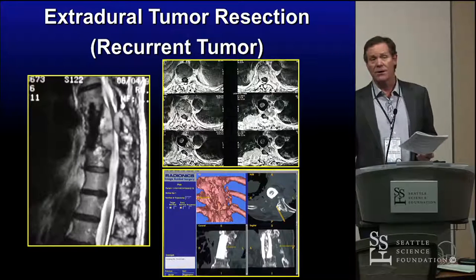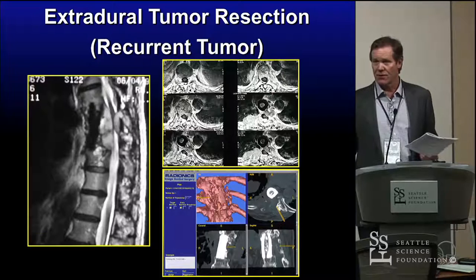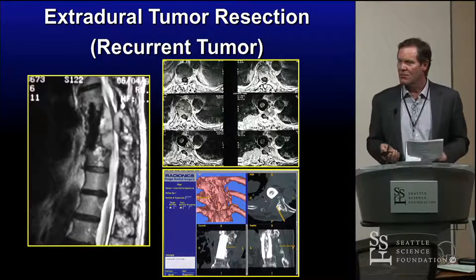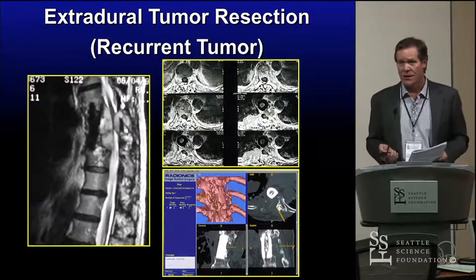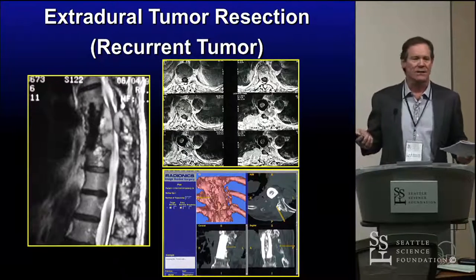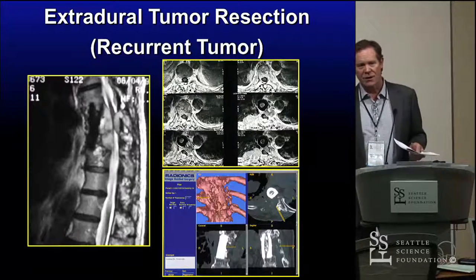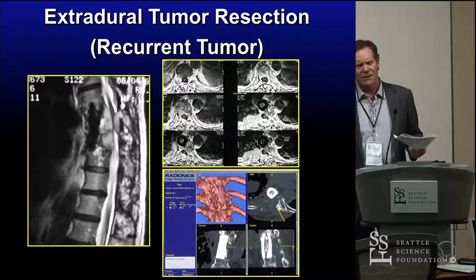But if you think about it, what about a far lateral disc? Could you imagine using it for a far lateral disc? I could. We did a bunch of them recently. We talked about it and said, gee, maybe we should use the image guidance. We haven't done it yet, but this is my talk, I get to say where we do it. We don't need it for absolutely everything. But there are certain decompression cases where I just want to see where we're operating and where we're pointing.